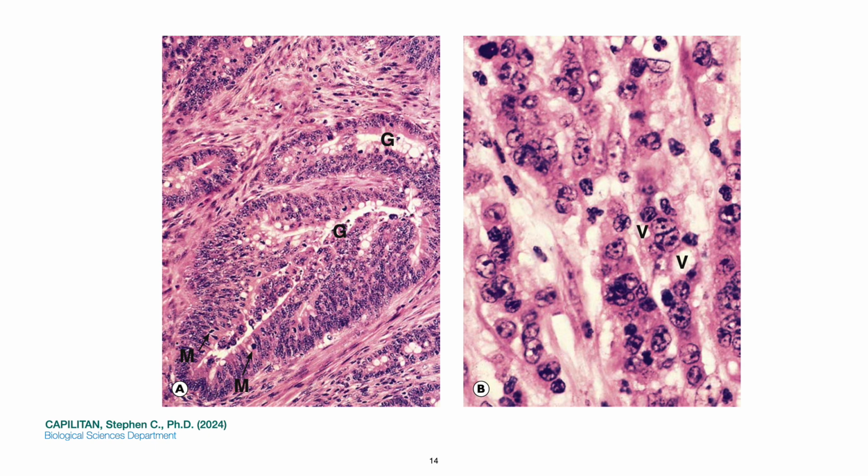Unlike the normal colon, the glandular pattern is irregular and there is little evidence of mucin secretion. Poorly differentiated adenocarcinomas in letter B display a minimal tendency to form a glandular pattern, and these cells are extremely pleomorphic. The only evidence of glandular origin is the presence of occasional cells with secretory vacuoles in V containing mucin.